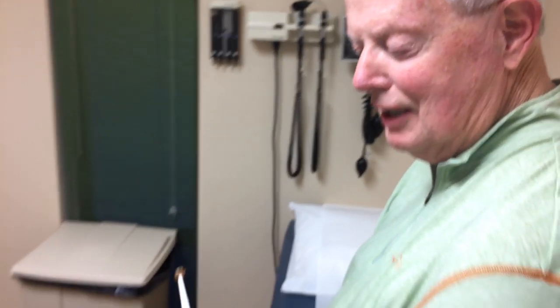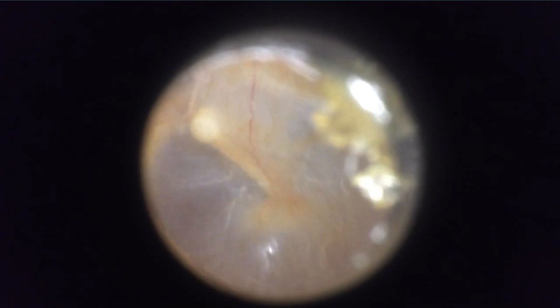Do you want to see what it looks like? Oh nice! So there's a little bit of wax still on the sides — adherent. The reason we don't get all of the wax out is because it was so hard and attached so adherently that we would cause injury, abrasion, and bleeding if we removed it all.